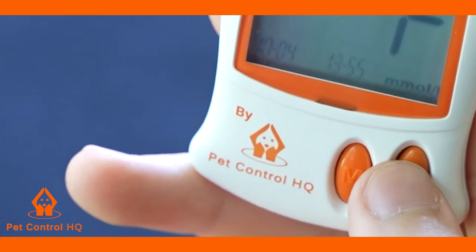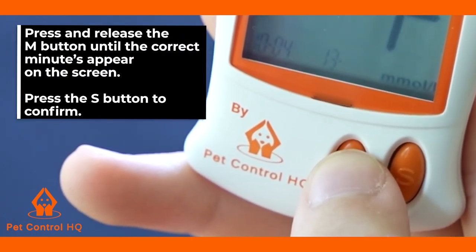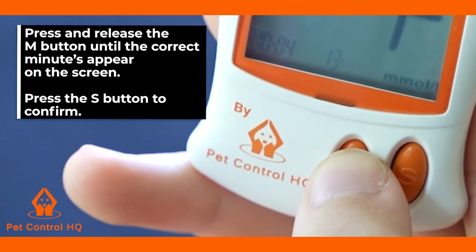To change the minute setting on the screen, press and release the M button until the correct minutes are displayed. Press the S button to confirm.